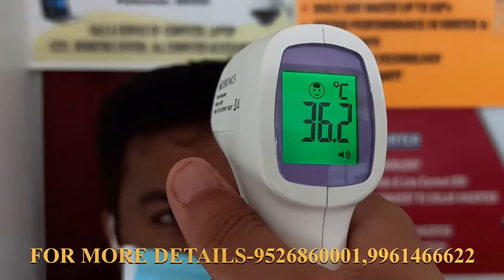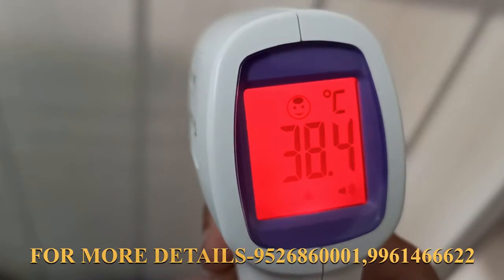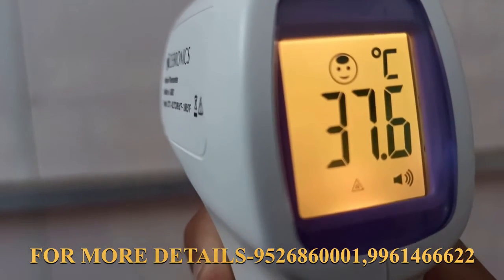A normal temperature is shown in green color. A high fever reading is displayed differently, and a normal fever is indicated as well.